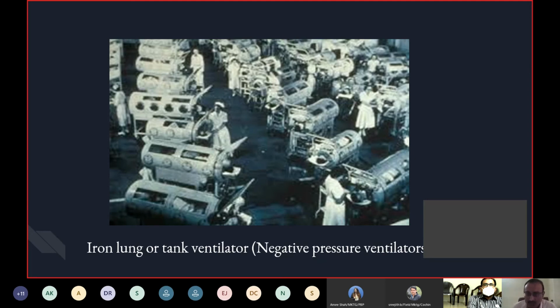Now, is it still being used? In 2018, two years back, there was a patient, I think called Anna or something like that, who was being ventilated. She was a post-polio patient who later on had a secondary event and then went into muscle weakness. In the night, for around 6 hours, she was in the ventilator. She was calling it the yellow tank because it was painted yellow.